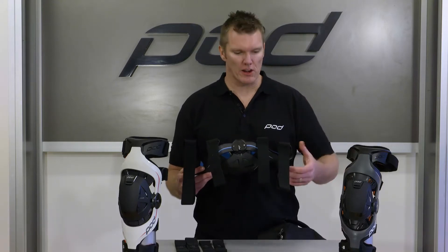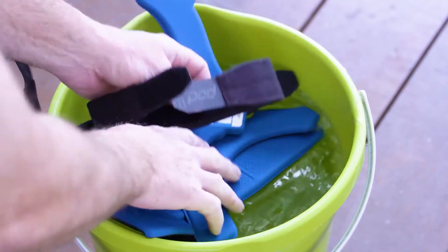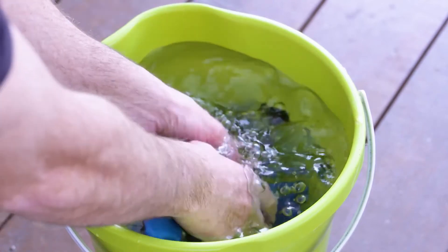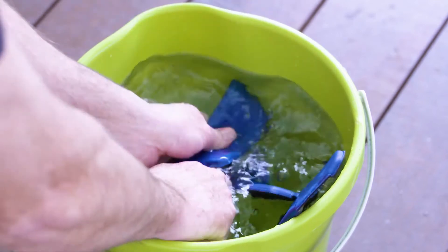You can care for these, so we do encourage you to wash them. Like the padding, you can quite simply take all four of the straps off and wash the dirt, the mud, anything that may be inhibiting or restricting that male and female Velcro from comfortably sticking.